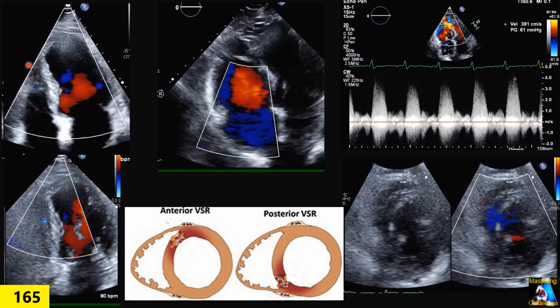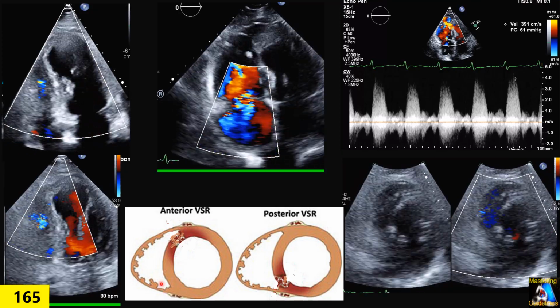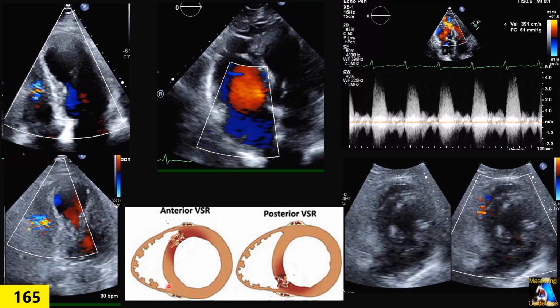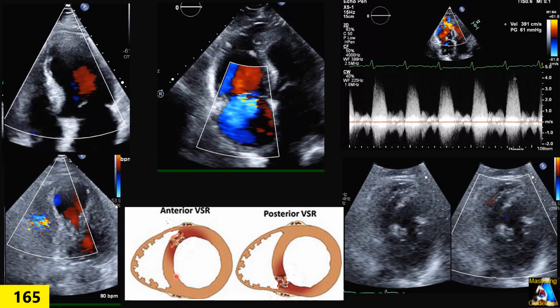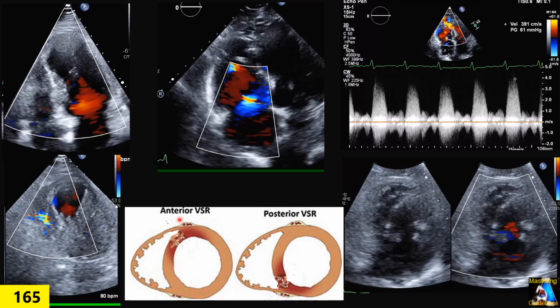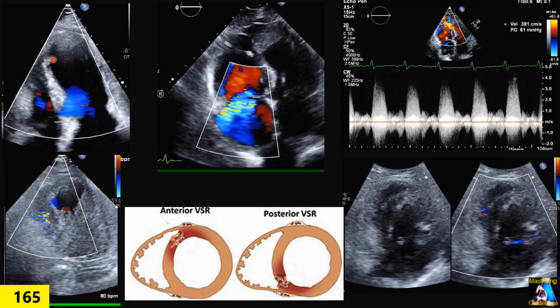You have to put color there and start from the basal view, fanning down until your four-chamber disappears. Then slowly with the color fan up toward the roof until you survey all the septum to the anterior, and slowly watch that area for any abnormal jet.